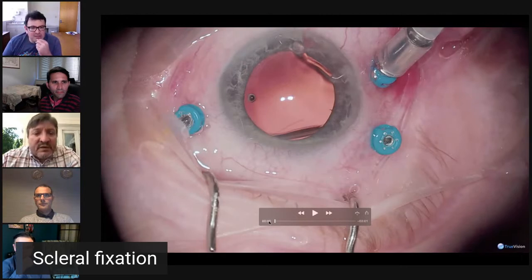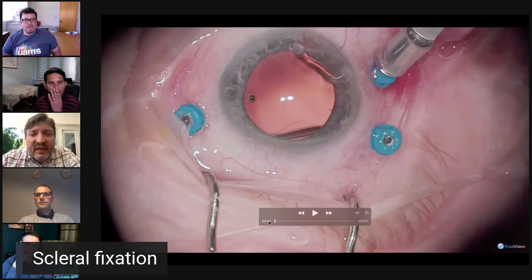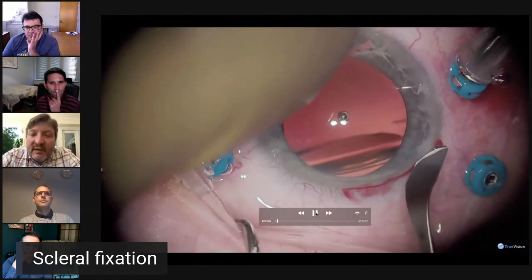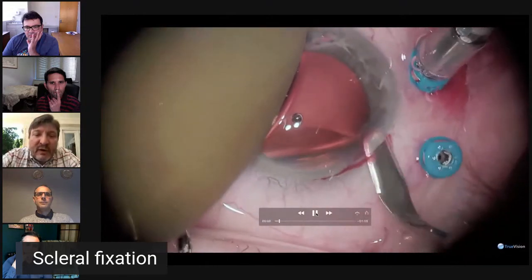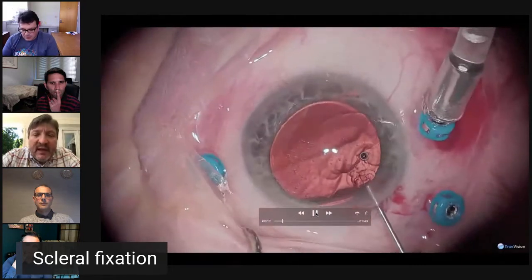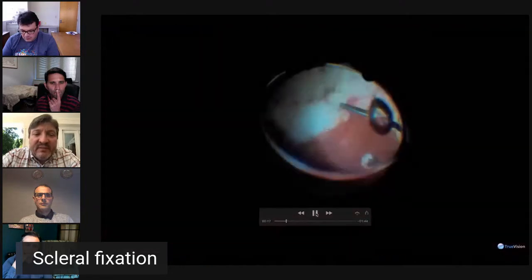Chris, please. So I'm glad you mentioned the whole idea of glaucoma. This is a patient with glaucoma, and our goal here was to try to place the scleral sutured CZ70 lens without opening the conjunctiva. And this is how we did that. So we make a 7 millimeter near limbal triplanar wound, and fill the anterior chamber with viscoelastic. And then we're able to just rotate and flip the lens up.